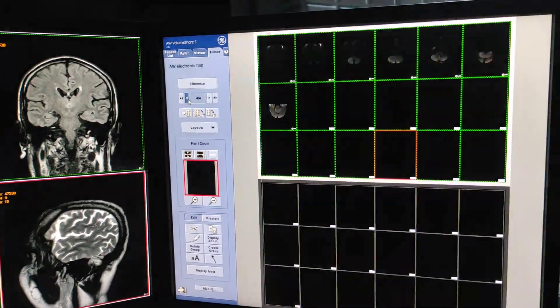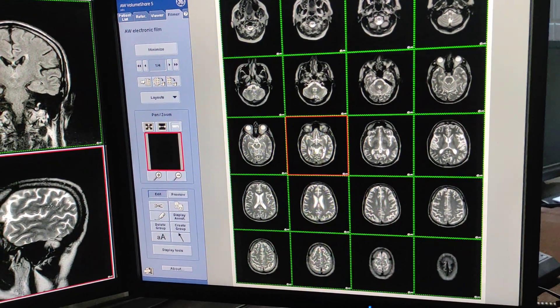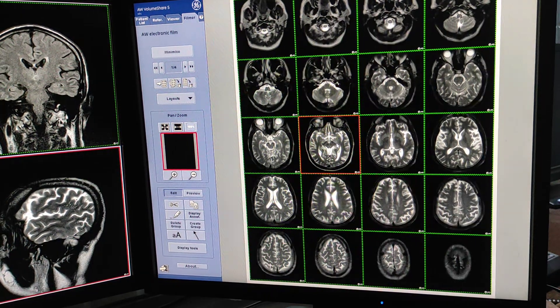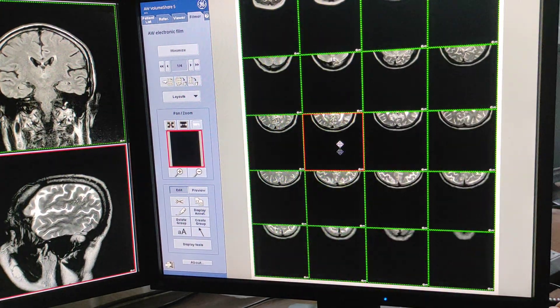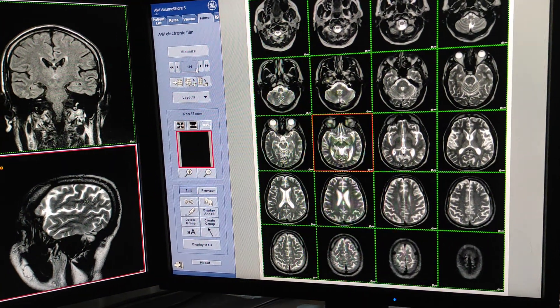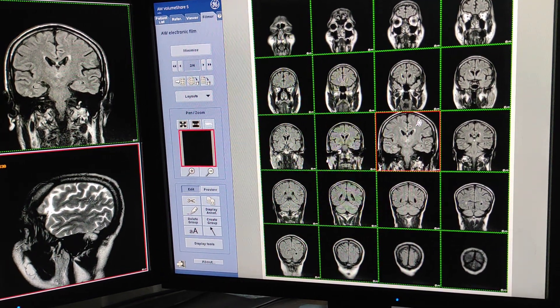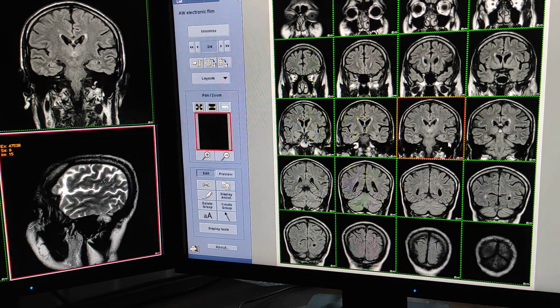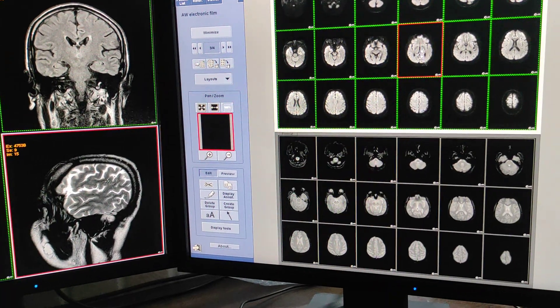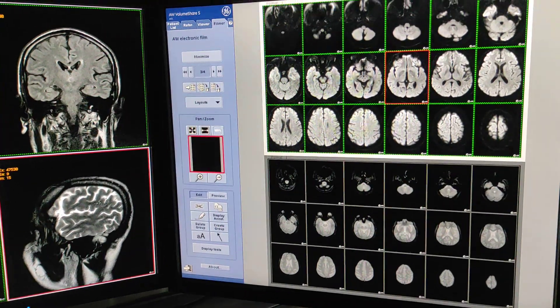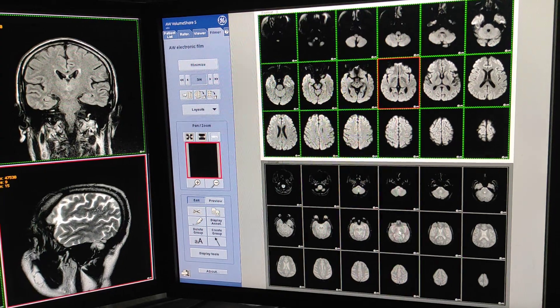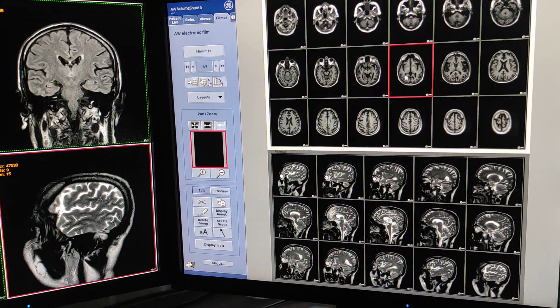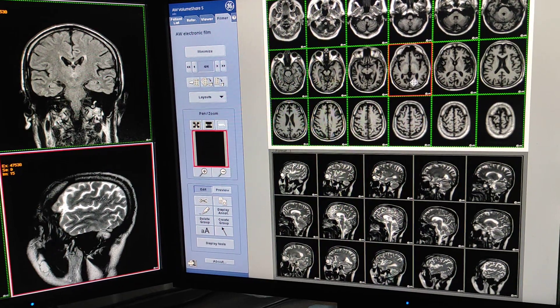Now my four films are ready. Select all the films — they turn green when selected. Right-click, zoom, set according to the box, and set the level window. For the second film, coronal FLAIR — double-click, zoom, set according to the box. Set level window. Double-click zoom on gradient. Four films are enough. T1 again — zoom and set the level window.